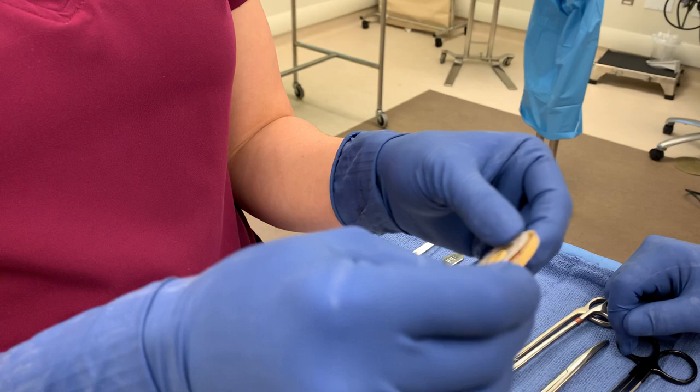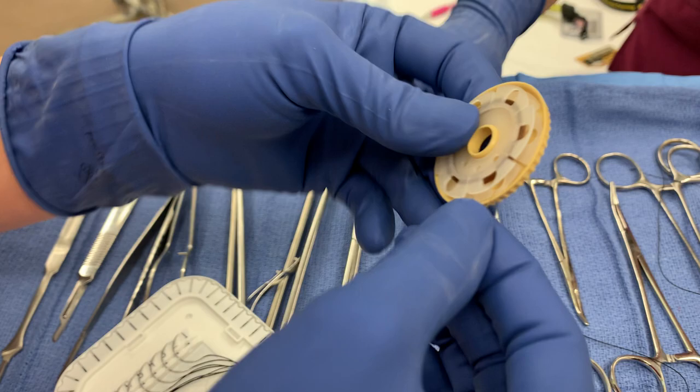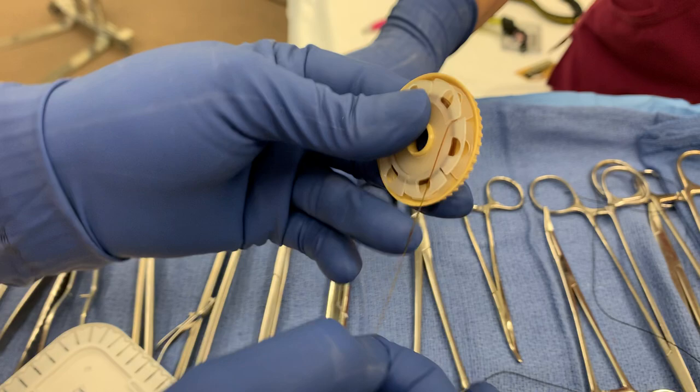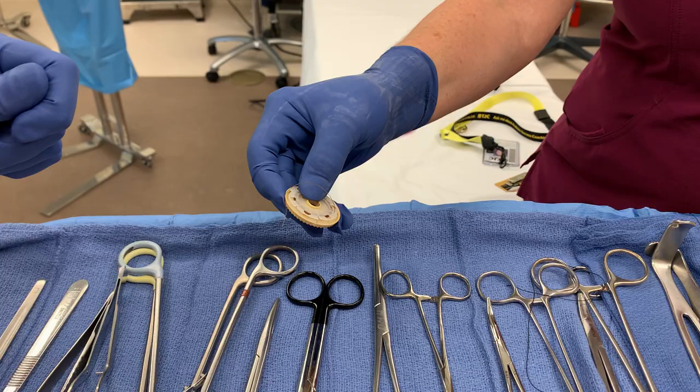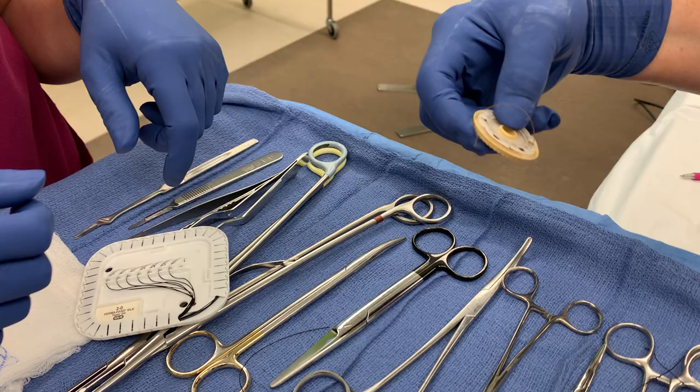Now a suture reel. This can be silk, but this one is chromic gut, which was in alcohol — so if you open it too soon, the chromic will dry out. Wait to open this one until you're ready to use it. It's usually wound pretty tight — you just pull out just a little bit. When your surgeon needs it, you just pass it to them like that. Make sure you pull a little bit out so it doesn't get lost in the reel and your surgeon doesn't have to go looking for it. And that is the end of the first video.